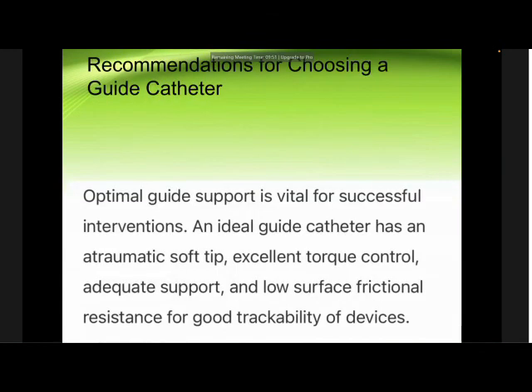So, how should we choose an optimal guide catheter for our intervention? An ideal guide catheter should have an atraumatic soft tip, excellent torque control, adequate support, and low surface frictional resistance for good trackability of devices.